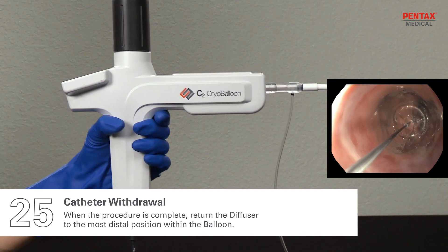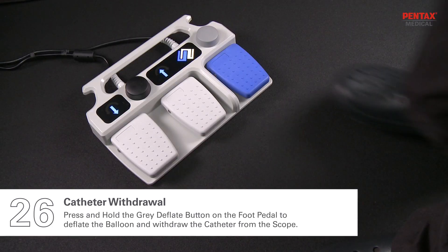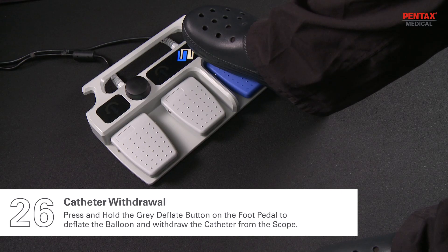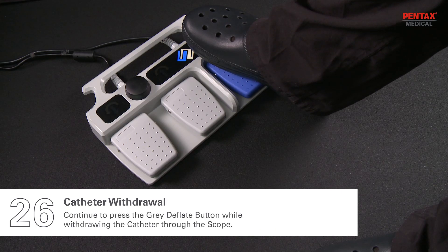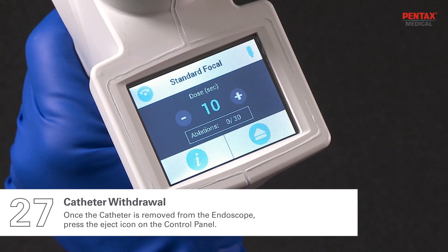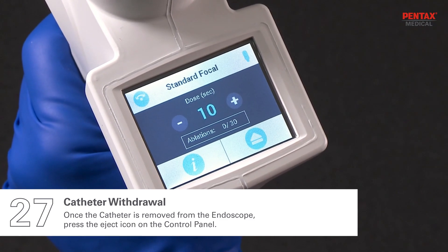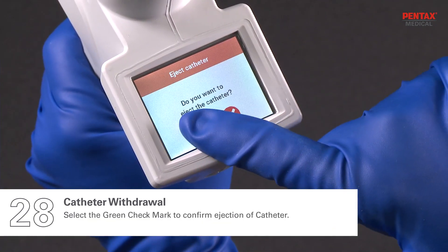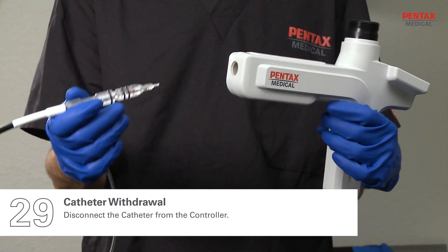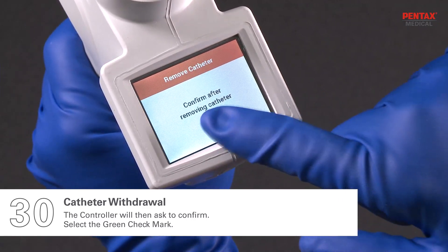When the procedure is complete, return the diffuser to the most distal position within the balloon. Press and hold the gray deflate button on the foot pedal to deflate the balloon and withdraw the catheter from the scope. Continue to press the gray deflate button while withdrawing the catheter through the scope. Once the catheter is removed from the endoscope, press the eject icon on the control panel. Select the green check mark to confirm ejection of catheter and disconnect the catheter from the controller. The controller will then ask to confirm — select the green check mark.